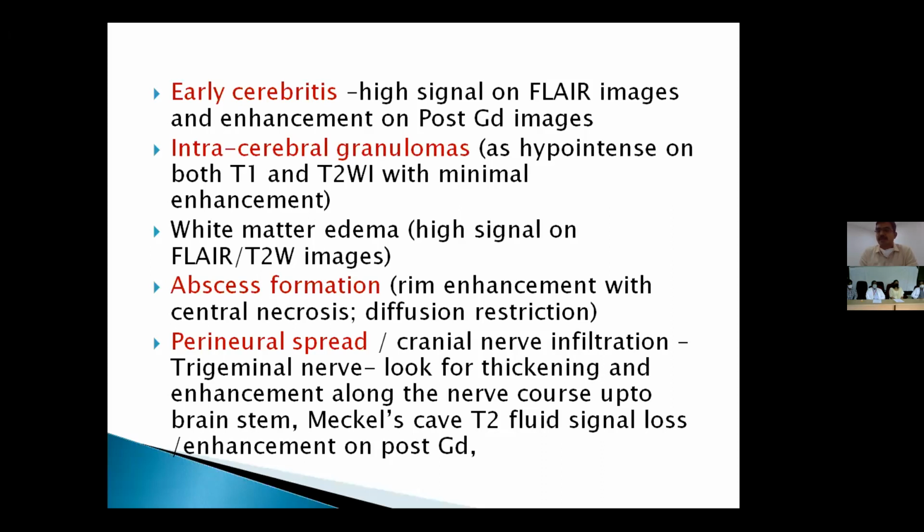Fungal abscess formation can occur, which will show rim enhancement on contrast images with central non-enhancing necrotic areas and diffusion restriction. Later on, perineural spread and cranial nerve infiltration can also occur, which needs to be evaluated, as I said before, by a 3D sequence and all.